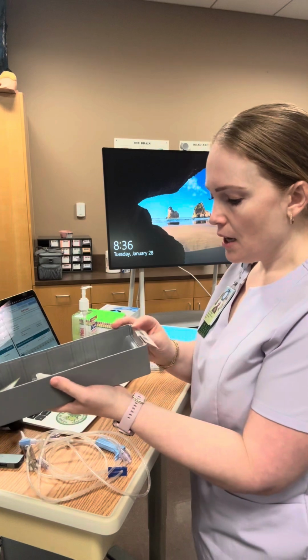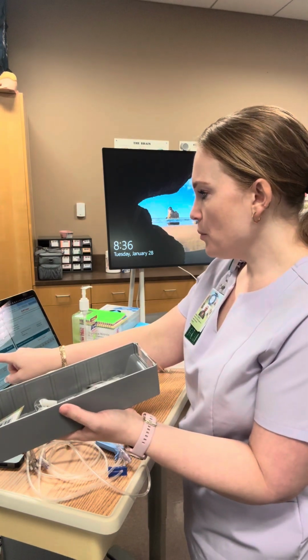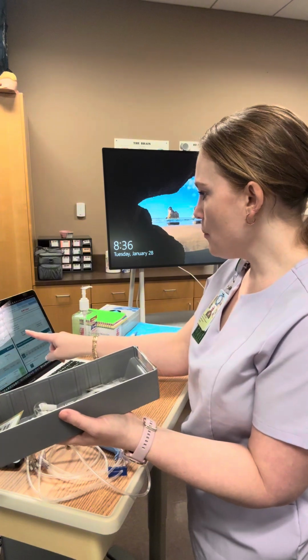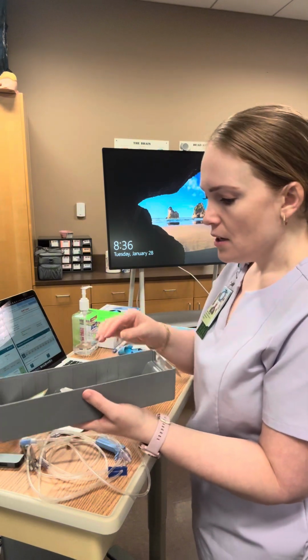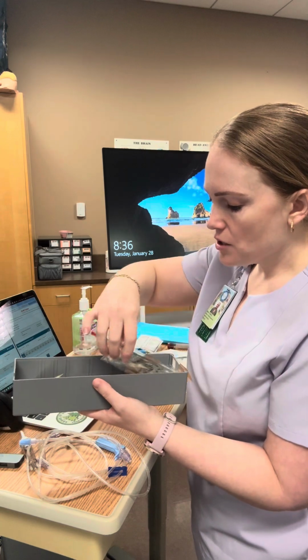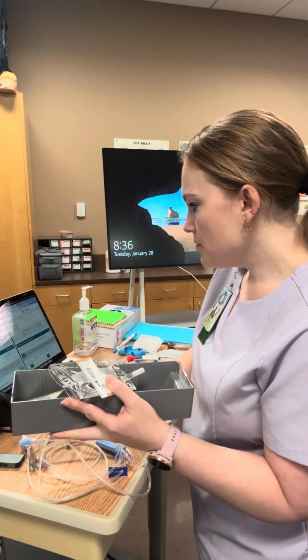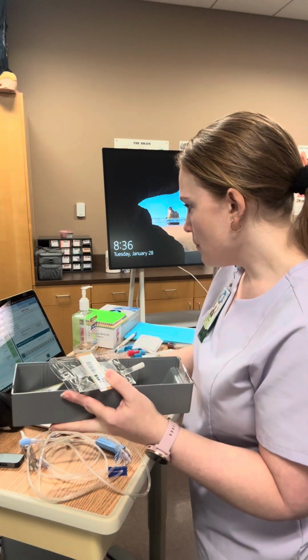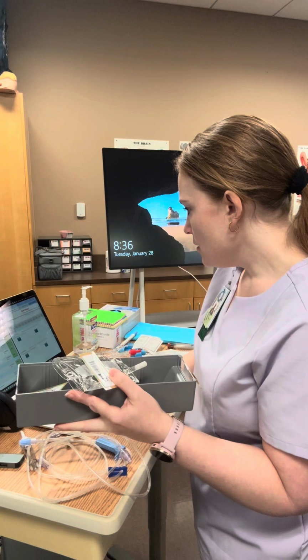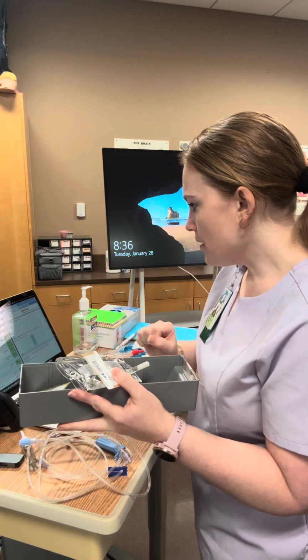med check 1. I have Code Brown 61851. On my orders, Code Brown 61851, and on my MAR, Code Brown 61851. I have the right patient. The medication I'm going to be giving is sodium chloride. Let me look at my orders for sodium chloride. Sodium chloride. Let me look at my MAR for sodium chloride. Perfect. I have the right drug.